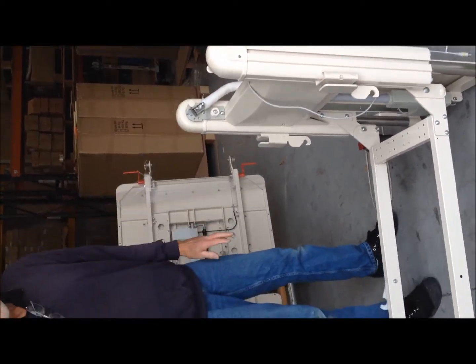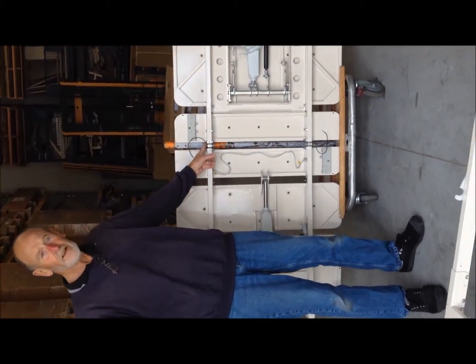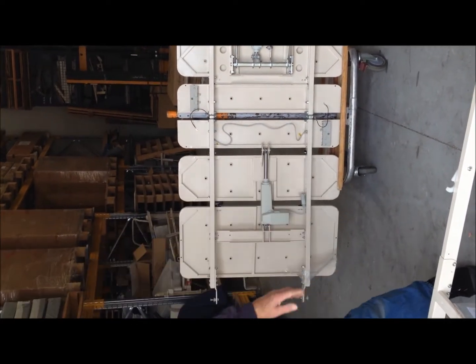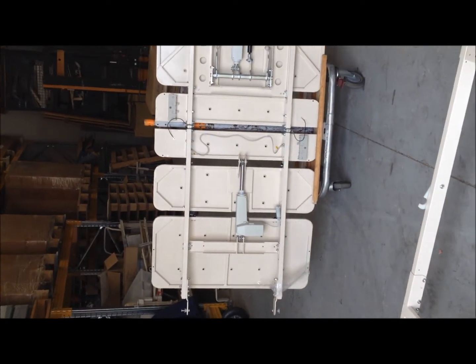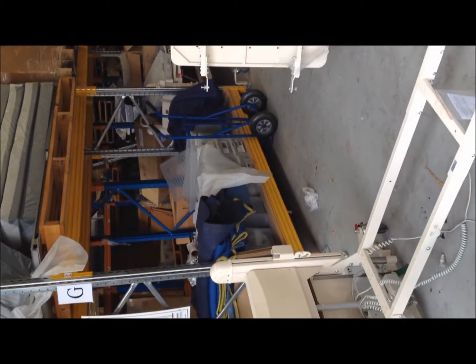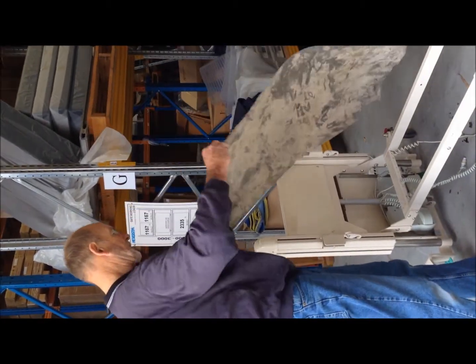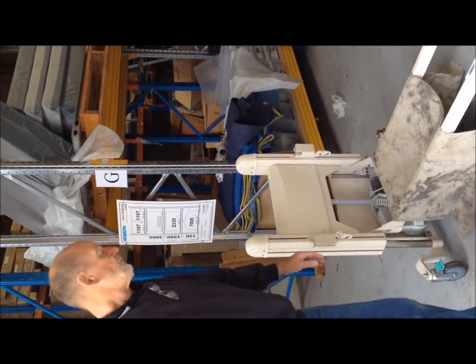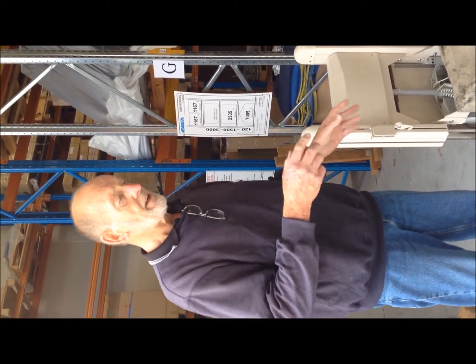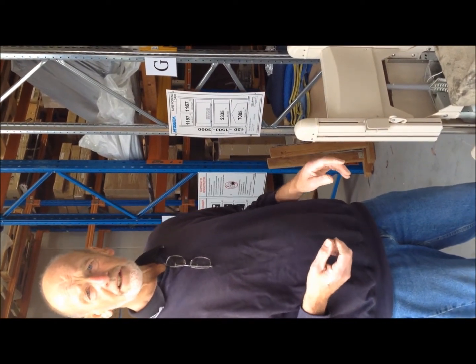Right, that bed's ready now to put the platform on. The platform's been unfolded. I've put the pins in. The pins are in. The only thing I haven't done is put the mattress retainers on. We can do that last. So you have the bed around, I use a blanket. That's so you can slide the bed down towards the hooks quite easily without scratching the platform.